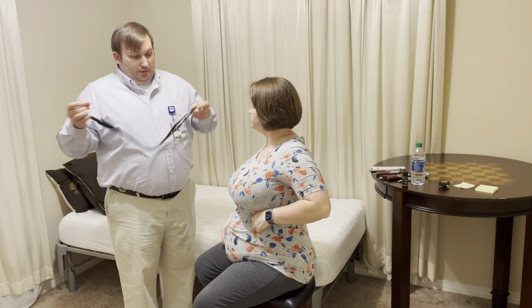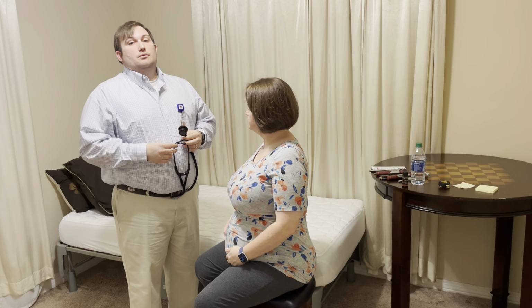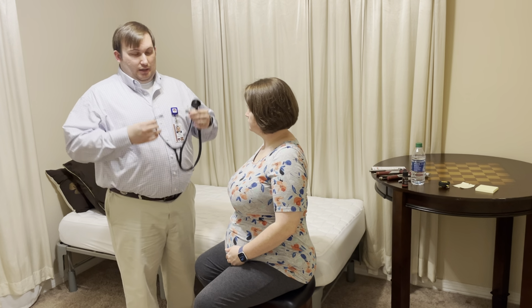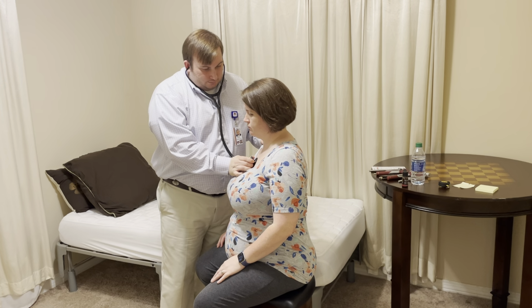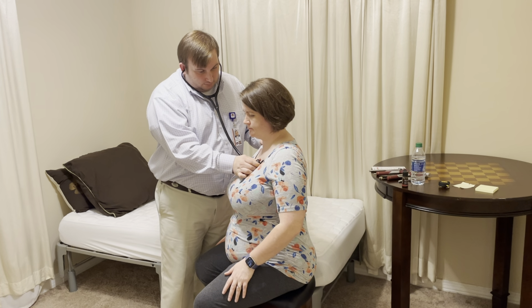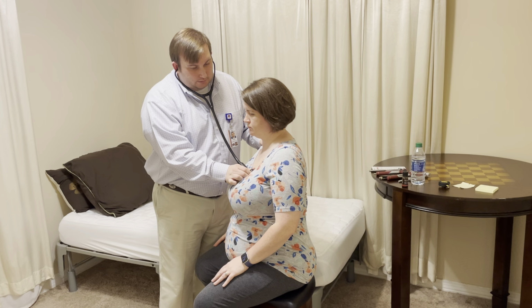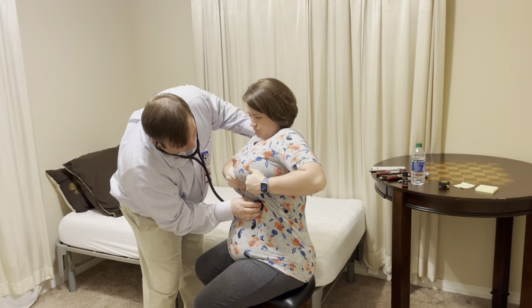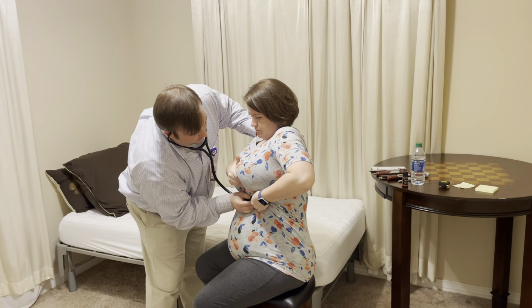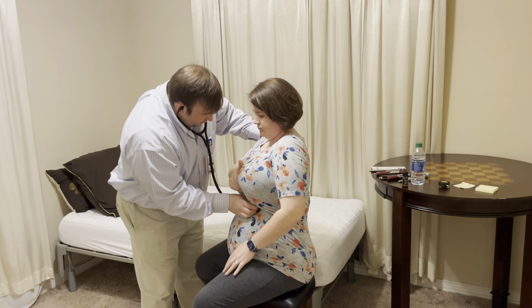Now I'm going to go ahead and listen to her heart sounds. Oh, sorry, no heaves or thrills noted at either. Okay, just breathe normal. Aortic, pulmonic, Erb's point. Tricuspid would be at the 4th intercostal space, and then I'm going to go ahead and check the 5th intercostal space. There we go. Okay, good job.